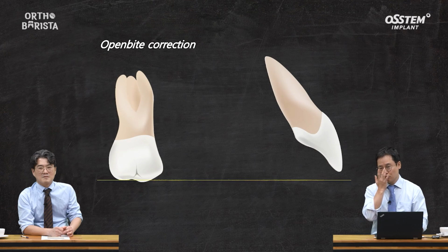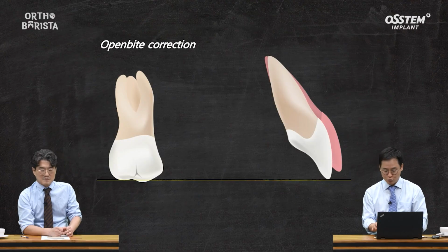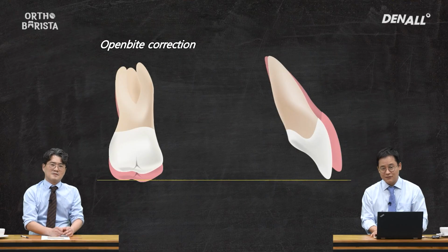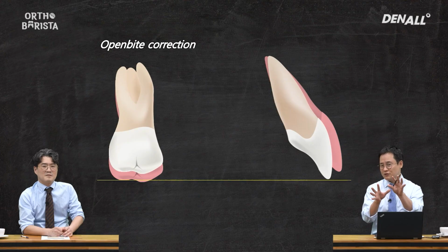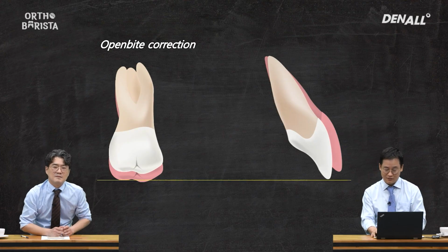Unless we take a really strategic approach, taking the teeth in parallel backwards is really difficult. Moving teeth backwards itself is great. If we can address at this level, it is a success for clear aligners. For second, posterior teeth will be moved up while the anterior teeth will be pushed down. I think this concept is quite common in clear aligners, and the one before as well.